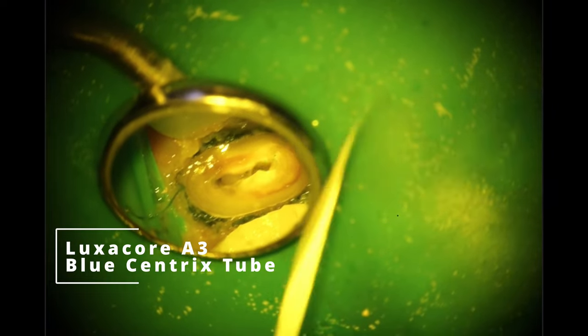When I do buildups on a tooth like this that's pretty broken down, I like to completely encapsulate the tooth. The reason is there's going to be shrinkage of the composite — this is kind of a David Clark thought. If you can completely envelop the tooth, it's going to shrink inward, because with a full 360 degrees of composite around the outside, that shrinkage force will be toward the middle since it's all equal. You're kind of making a semi-crown out of composite. He's shown it's about as strong as a crown when you injection-mold it. We knew we'd have a traditional crown here anyway.